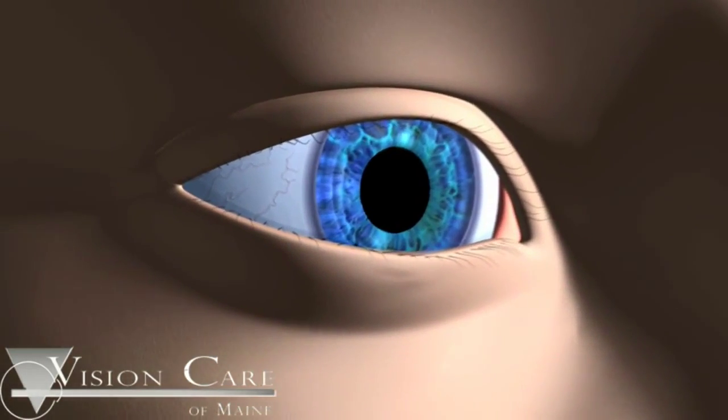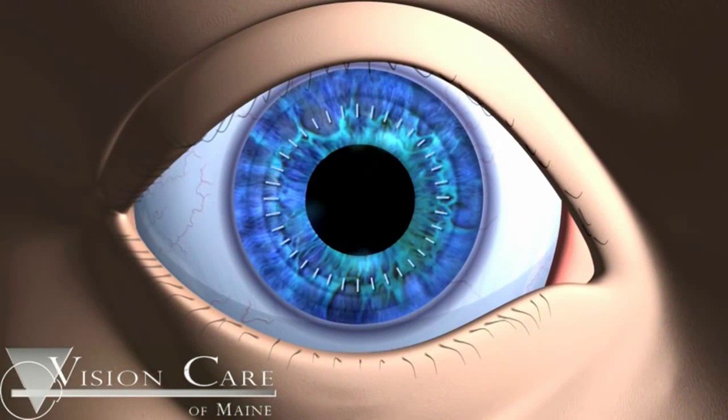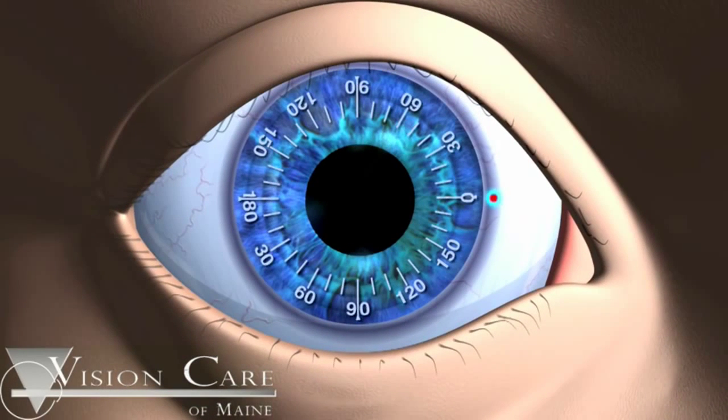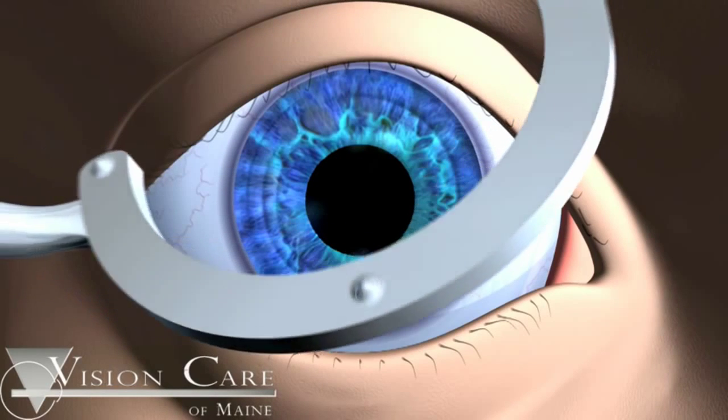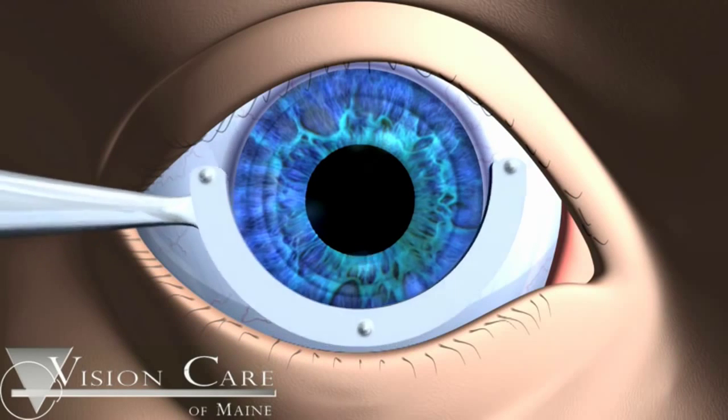To help the surgeon orient the ACRISOF IQ Toric IOL properly in the steep axis, a reference marker is used to mark the 0, 90, and 180 degree meridians of the cornea. The reference marks should be made prior to surgery, while the patient is sitting in an upright position.